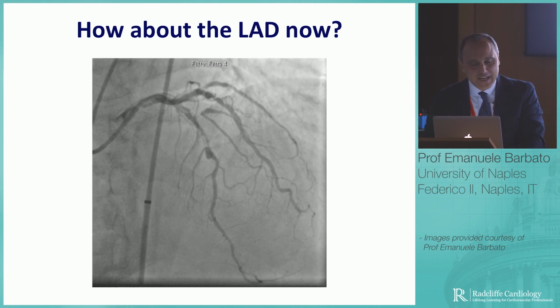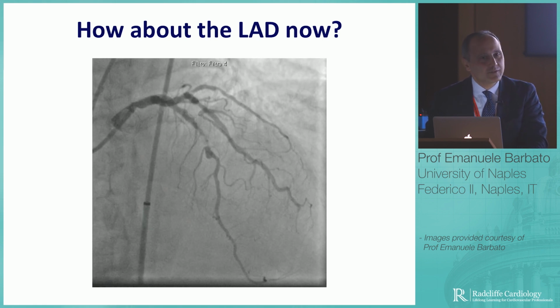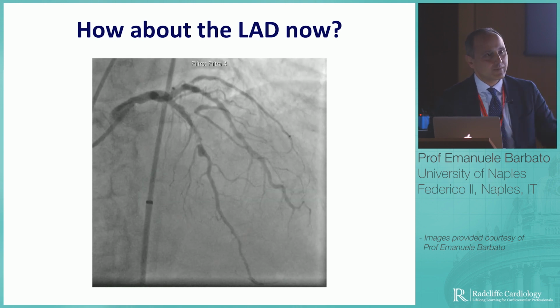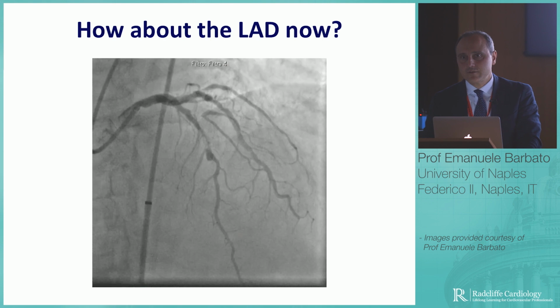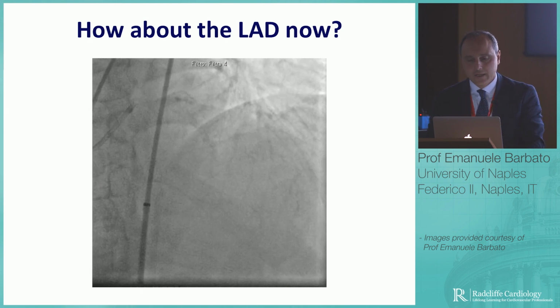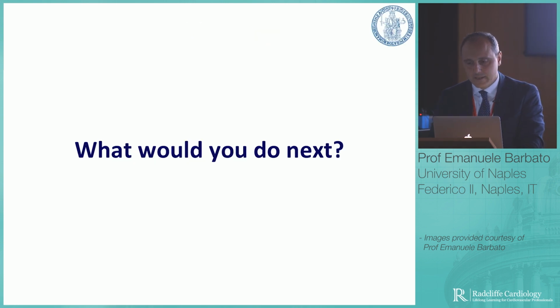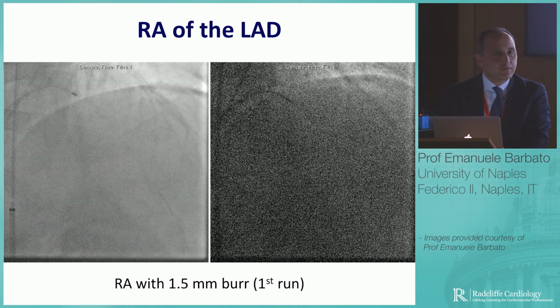I myself have seen a live case of a patient where shockwave was forcefully pushed in this kind of situation, ending up in an ugly complication upstream. So I think it's a beautiful device, a beautiful tool, but it should be used when it is most appropriate, and this is, I think, not the case. So what we did in this case was, again, rotational atherectomy, 1.5 millimeter burr.